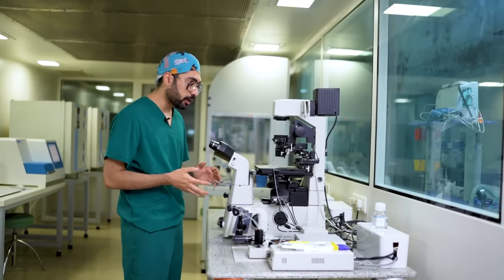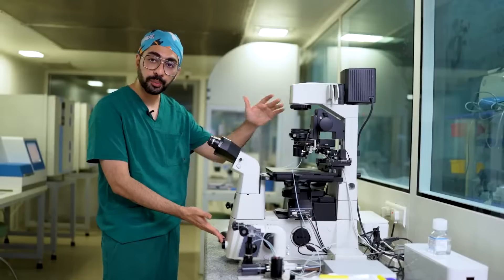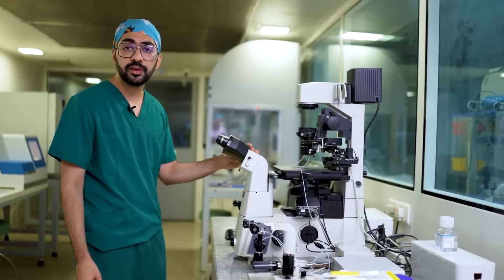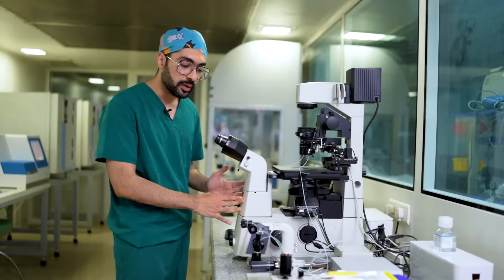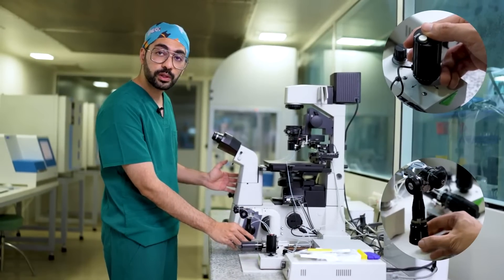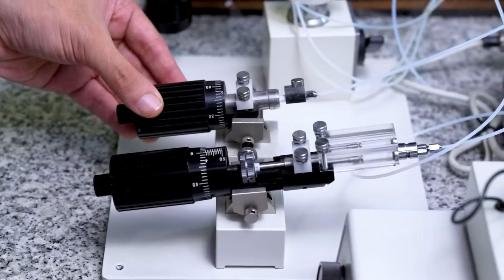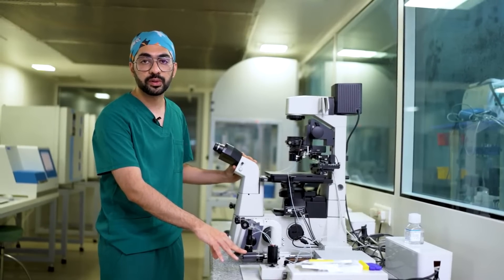When we talk about the micromanipulator, we have to first understand its parts. Basically you have an inverted microscope which you would use to visualize whatever you're using it for — maybe for ICSI, embryo biopsy, or even embryo grading. Apart from the microscope, you also have the manipulator component, which consists of motorized joysticks as well as manual joysticks and an injector. This injector could be pneumatic or hydraulic. Pneumatic means it has an air-based control system; hydraulic generally has an oil-based control system.